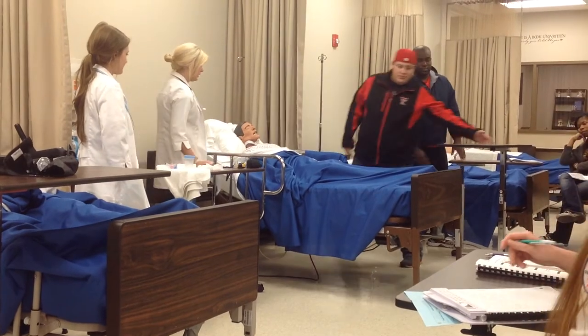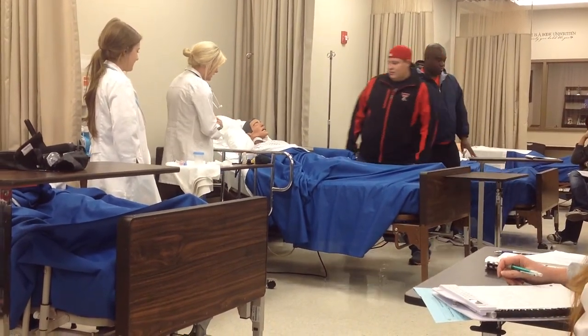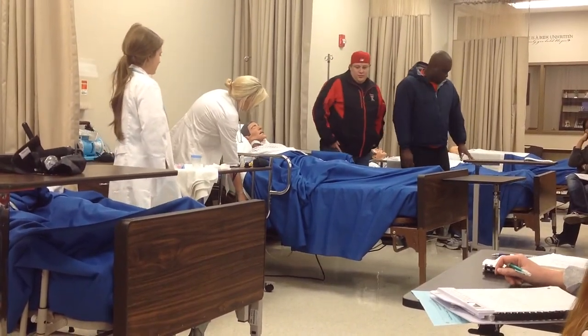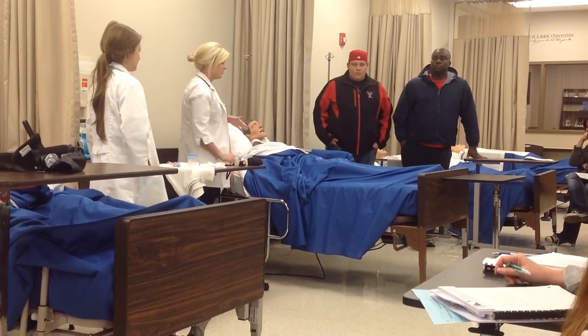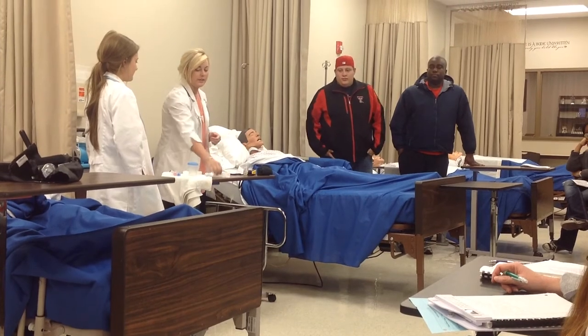So we're in your patient's room. You're going to walk through, obviously, and lower your bed rail. Your patient will be in the supine position. We just put it up so you can see. You're going to wash your hands and put your gloves on.